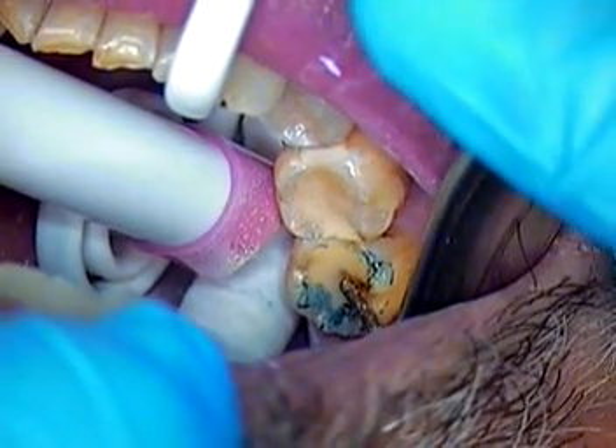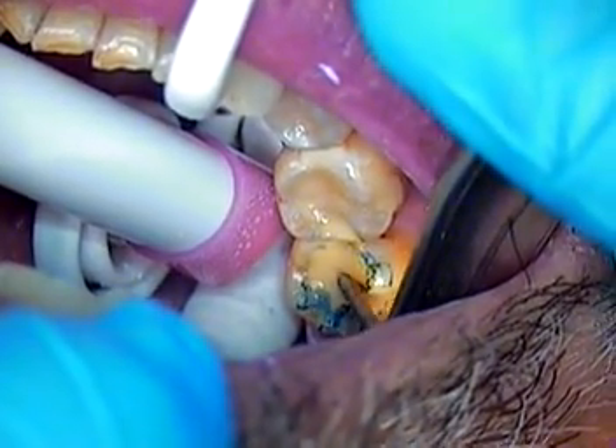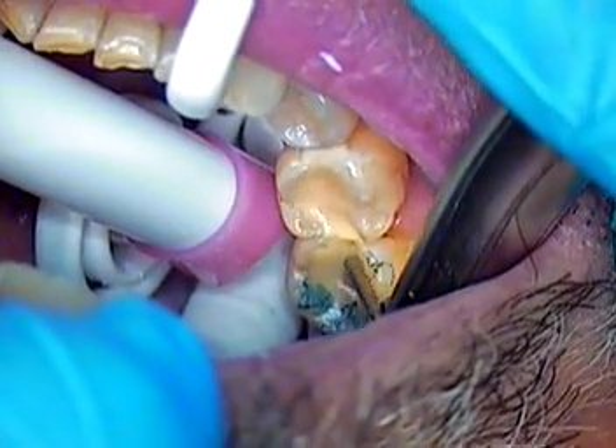We've pre-measured our burr. This is a KS0 burr. We're going to go 1.25 and 1.5 millimeters reduction. We're trying to get at least 1.5 reduction for posterior. It's going to be a monolithic restoration.